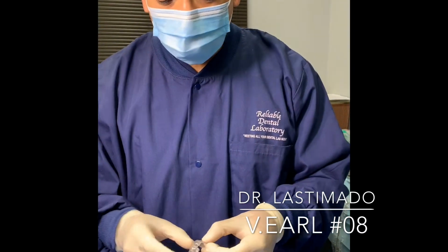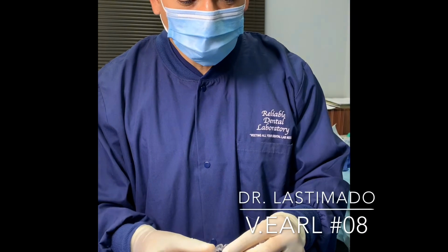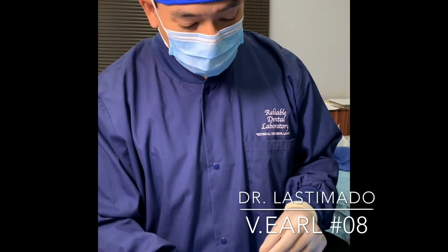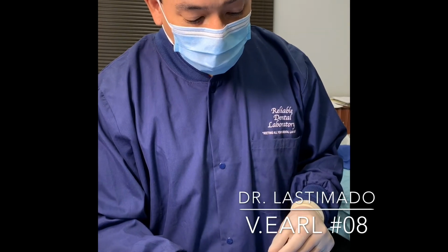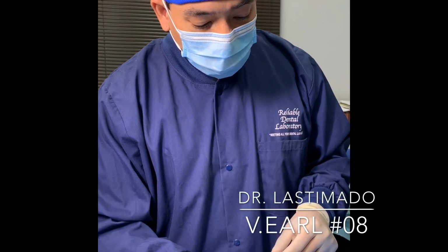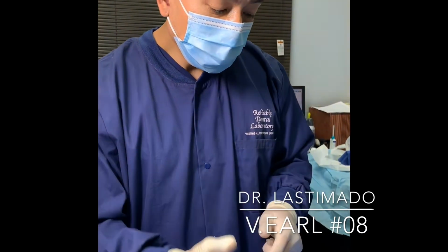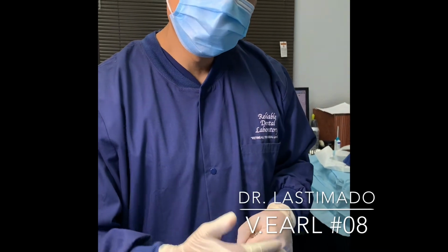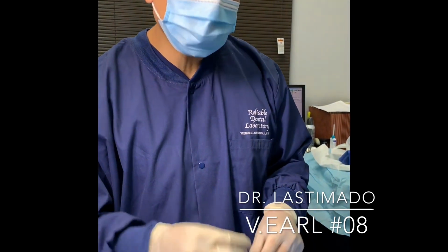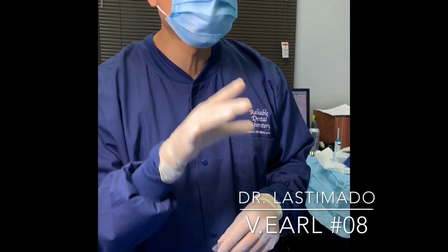And this is our nice open guide. What it is really is just a visual reference. And here's the cool thing. As we're drilling, you can see, I'm just going to place our 3.5 Hyacin drill. We are going to place a 4.0 NH implant, okay? And the whole idea is to not follow the teeth, but transport the implant preparation site slightly palatally, so that if we decide to do screw retained, the screw access hole is not coming out the facial or the incisal edge.